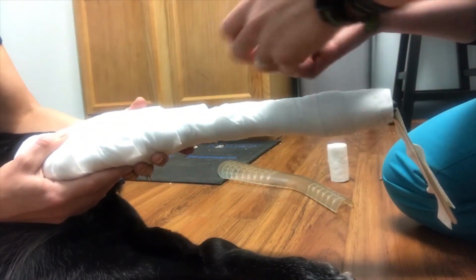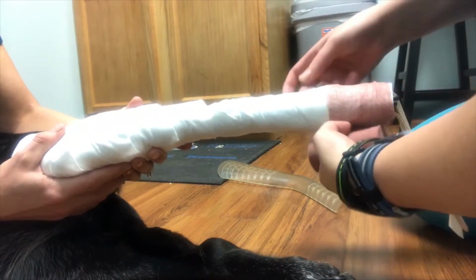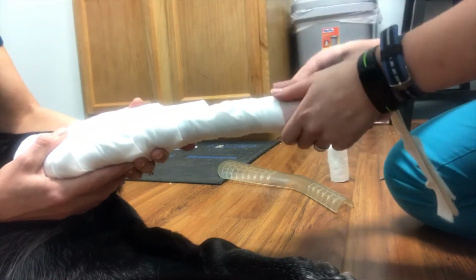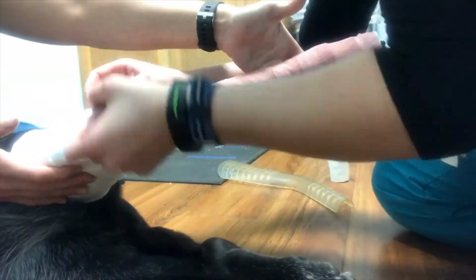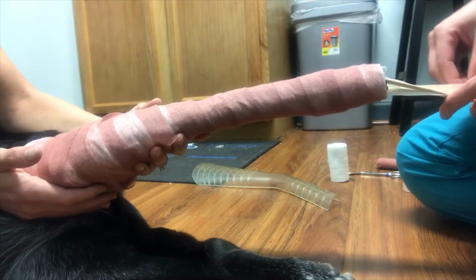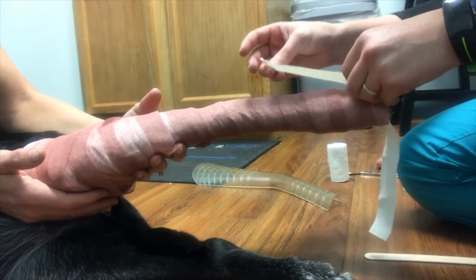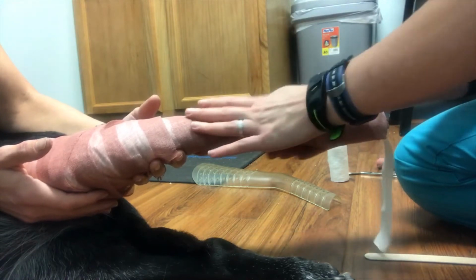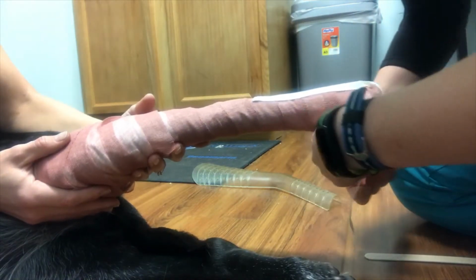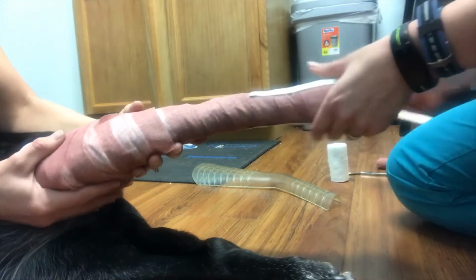Like I said, I'm going to use some of our tie gauze here. And the same method, I'm going to move distal to proximal up the leg with 50% overlap. I always like to check the splint at a couple points along the way so I don't have to backtrack. So now I'll place my stirrups. I'll twist them, lay sticky side down on both sides. Again, it's attached to the leg, and now it is also attached to the outer part of the bandage to help hold that bandage up and in place and prevent it from slipping down.